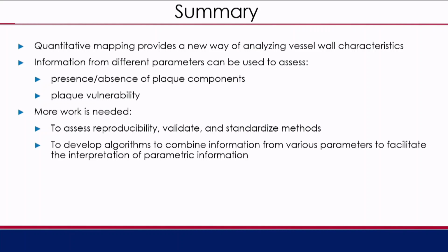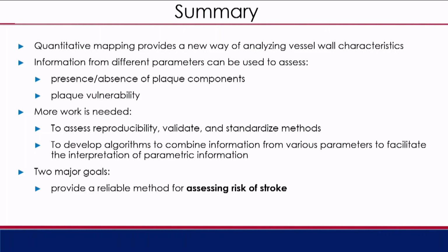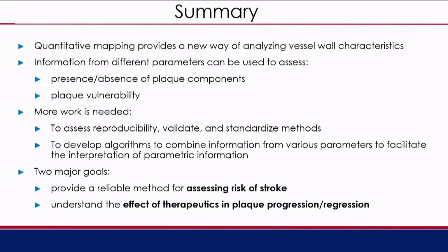It is really important also to develop algorithms that can combine this information from these various parameters to interpret what this means. And the two major goals are to provide a reliable method for assessing risk of stroke and to understand the effect of therapeutics in plaque progression and regression.